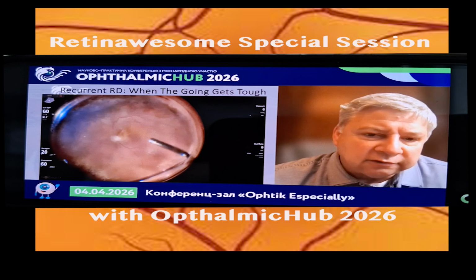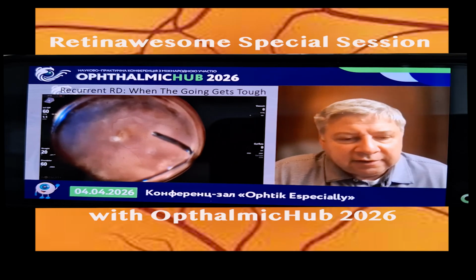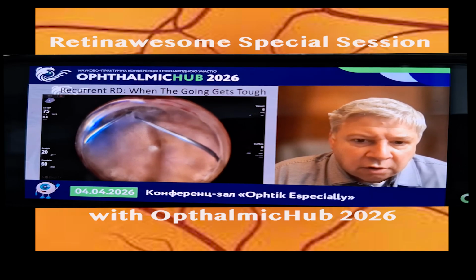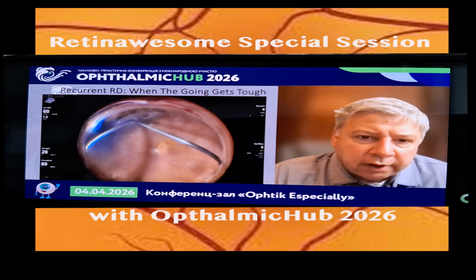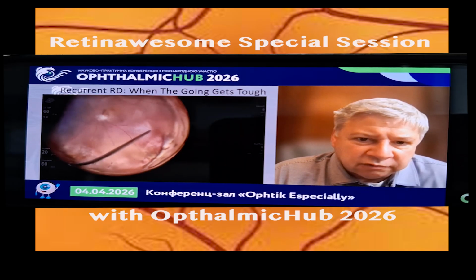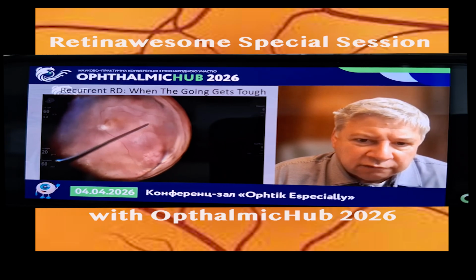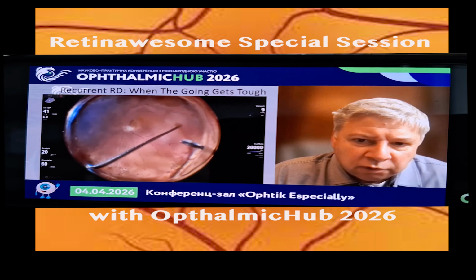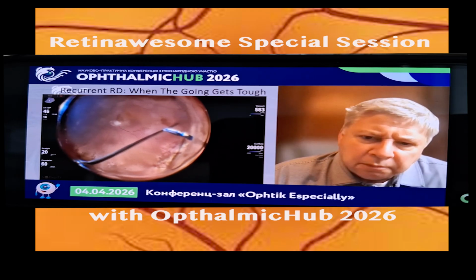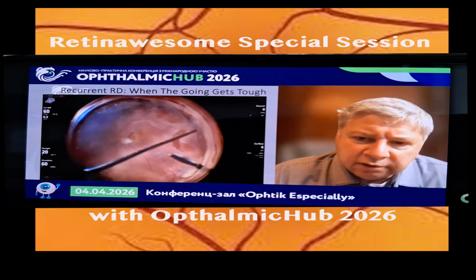So this is the case, multiple surgeries done elsewhere. This is just kind of a complex case. Right by the nerve, there's a large hole. There's some very adherent inferior PVR. This patient was previously buckled. So what we're doing here, there's some degree of foreshortening. We peel PVR membranes and then we're doing a retinectomy. But in addition to doing the retinectomy, we're cutting a patch graft.